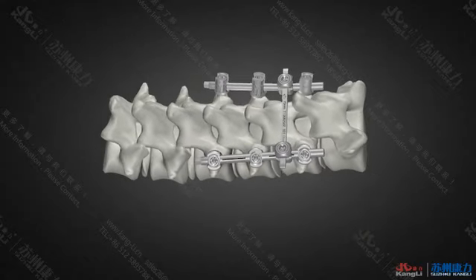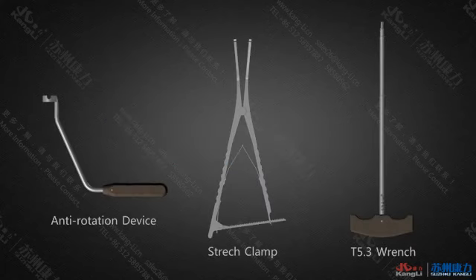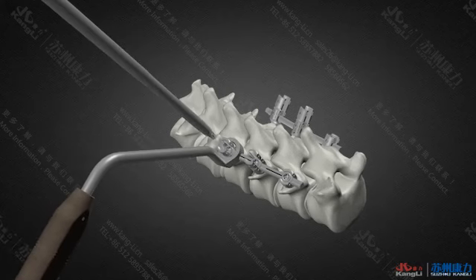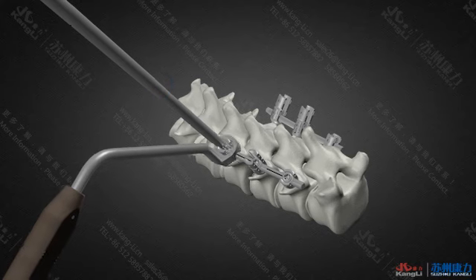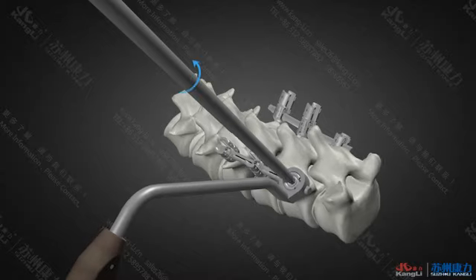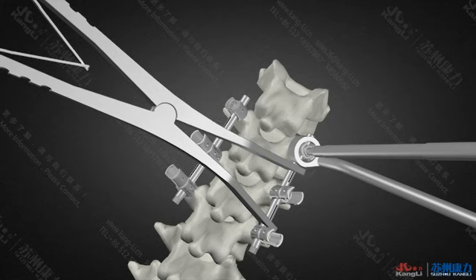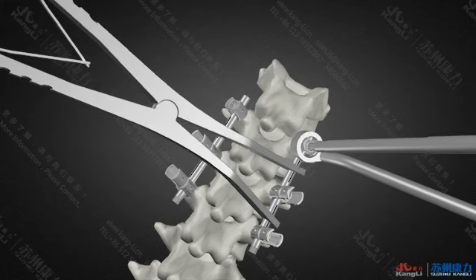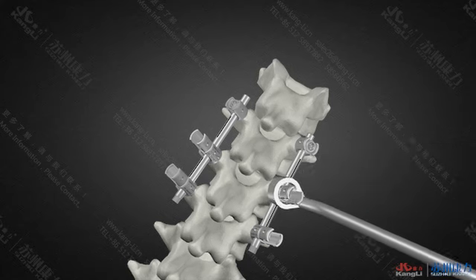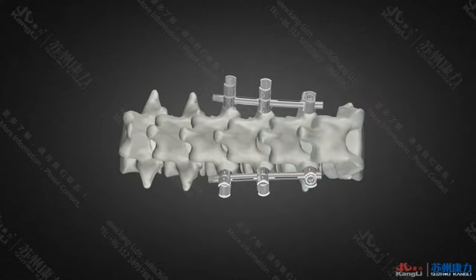The operation is finished. Operation demonstration of stretch fixation. Use the T5.3 wrench and anti-rotation device to fix the plug screw on one side, while the plug screw on the other side is loosened. Place the stretch clamp. Stretch slowly to the proper state, then wrench the loosened plug screw and finish the stretch fixation. Repeat the above to finish the operation of the other side.